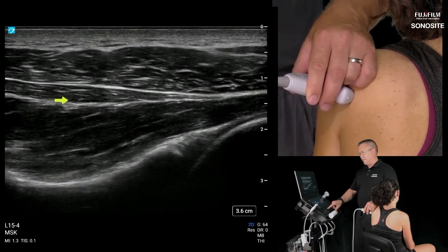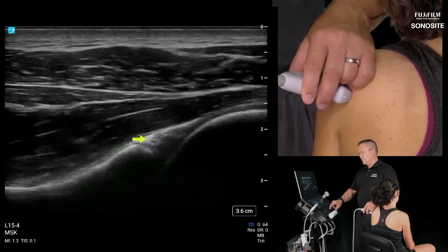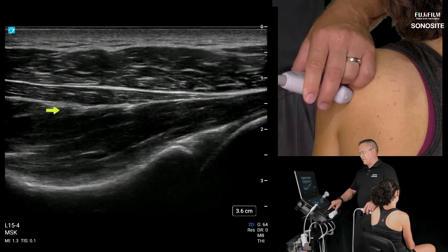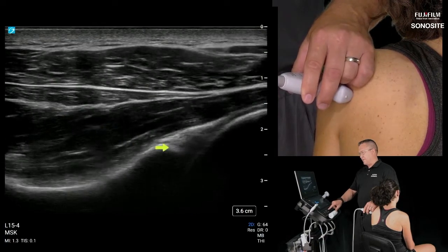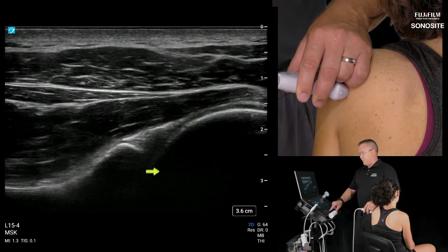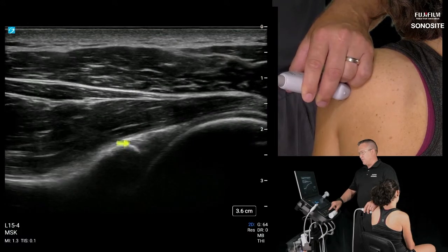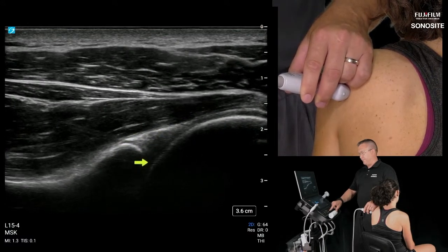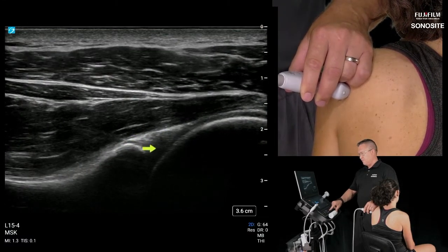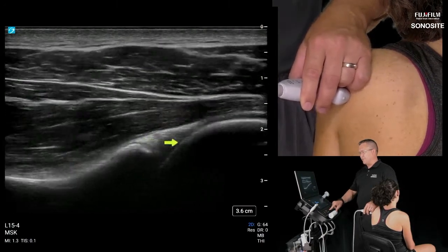And then above this is infraspinatus muscle and central tendon, one of the pinnate directions of the central tendon. We'll get to the rest of the tendon momentarily. So between the humeral head and the posterior glenoid tubercle, we have this labrum here. This triangular fibrocartilage of the labrum is shown really nicely on ultrasound, just in the posterior shoulder.